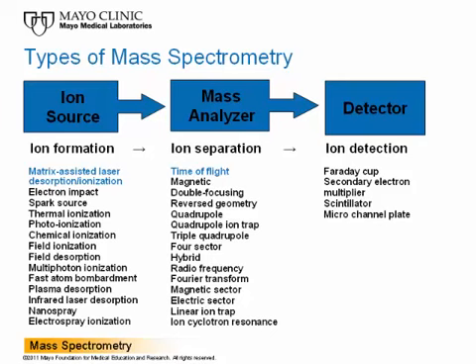proteomics became possible. Matrix-assisted laser desorption ionization is a soft ionization technique, allowing molecules to remain relatively intact during ionization. Proteins can be measured as little protein fragmentation occurs. Following ionization, the ions are separated, enabling measurement of mass. Using the approach covered in today's presentation, ions are separated by time of flight in a flight tube.